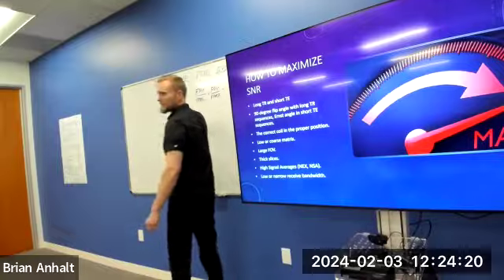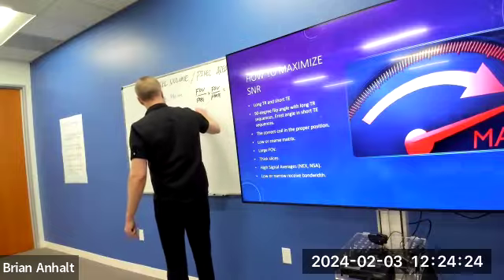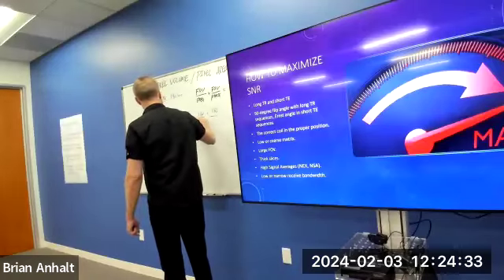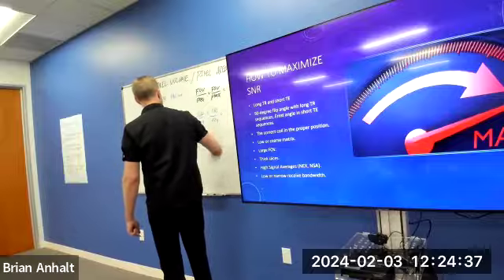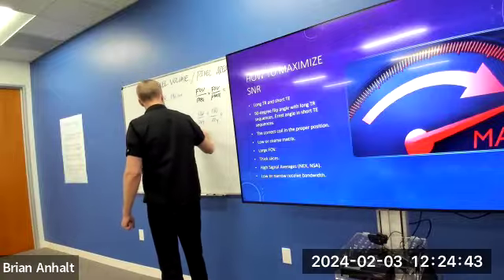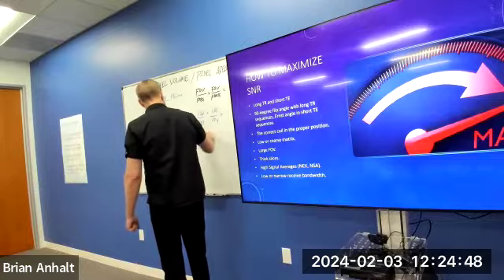Field of view, which is 180, it's already in millimeters, I don't need to make a change, right? I'll put that up there twice. And what do I divide it by? 384 and 224. What does this first one give me? 180 divided by 384 is 0.46, 0.47.